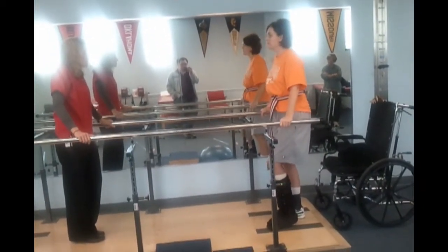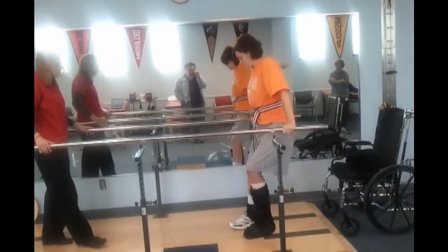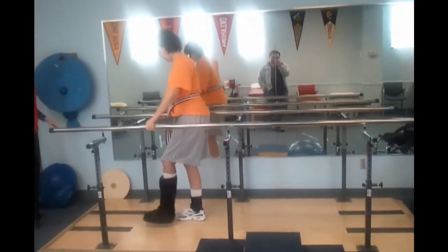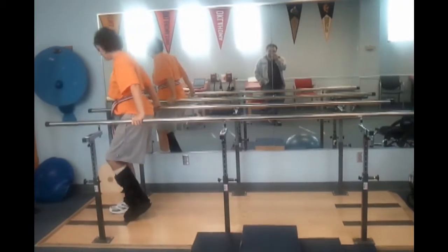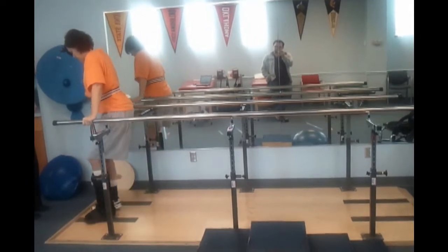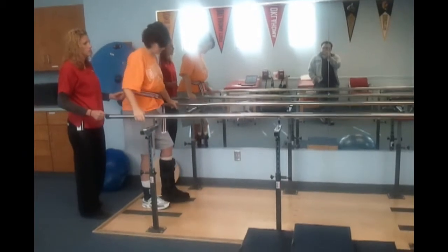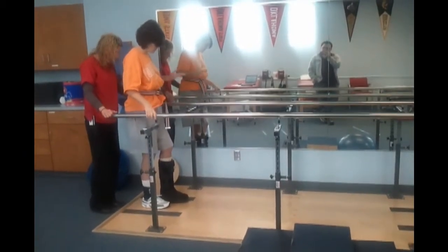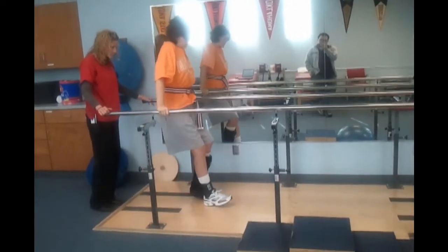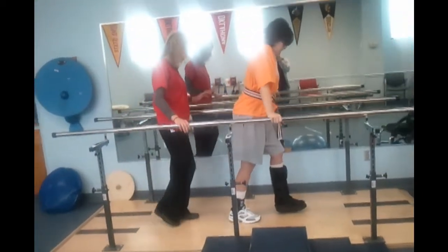Are your arms getting tired? Let's do one more down the back. So you can kind of grasp how it feels to put most of your body weight in your arms. The walker will carry most of your body weight — you don't have to worry about how hard you're pressing down on it. Truthfully, the harder you press on a walker, the more sturdy it is anyway, because you're loading it into the ground. My wrists are feeling more because all my work on my arms hasn't been like this on my wrists — you haven't been loading your wrists.